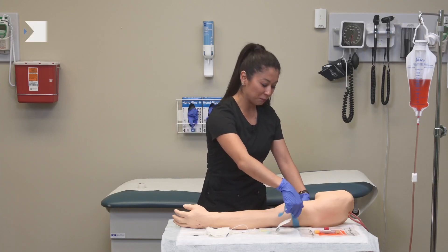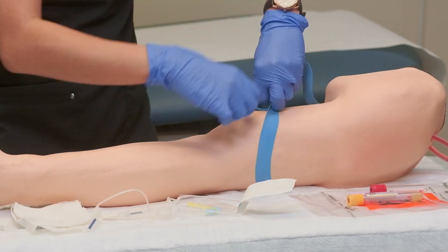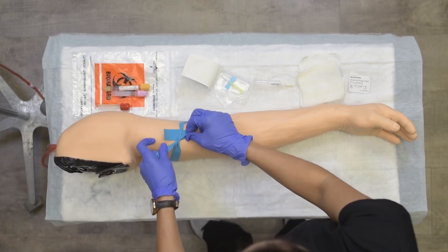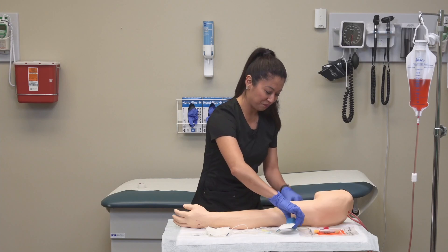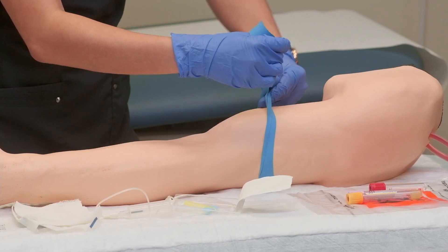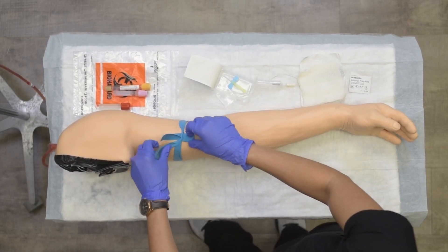When applying the tourniquet, I like to hold it a little bit closer to provide more tension, then cross my hands and gather it so you see a nice X. Then poke just this little side through so that when we're done, we can quick release. I'll show you the tourniquet one more time — grab the sides for tension, cross your hands gathering it in an X-like fashion, then take the tail and poke it through without going all the way, and leave it there.